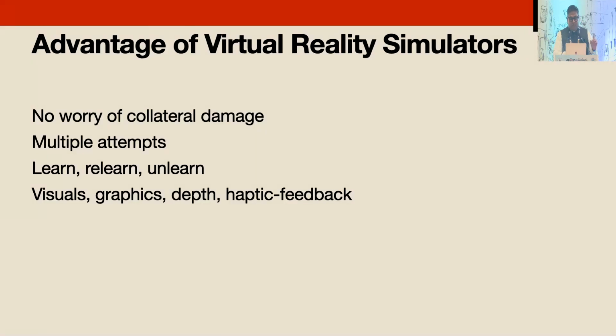And the advantage of a virtual reality simulator is that there's no worry of collateral damage. You can do a posterior capsule rent 100 times without worrying what is going to be the effect on the patient, because you're not doing it on a patient. You can learn, relearn, unlearn, and do that everything again and over again.